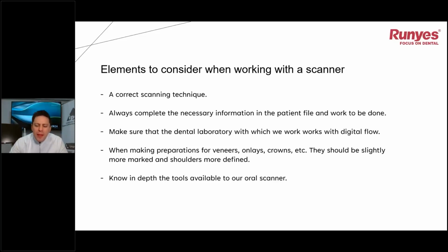This is something that I always say to everyone that I give lectures to, because it's better for the software and the CAD designer to see the shoulder of the preparation very well defined. It doesn't matter if it is a veneer or a crown or an onlay.